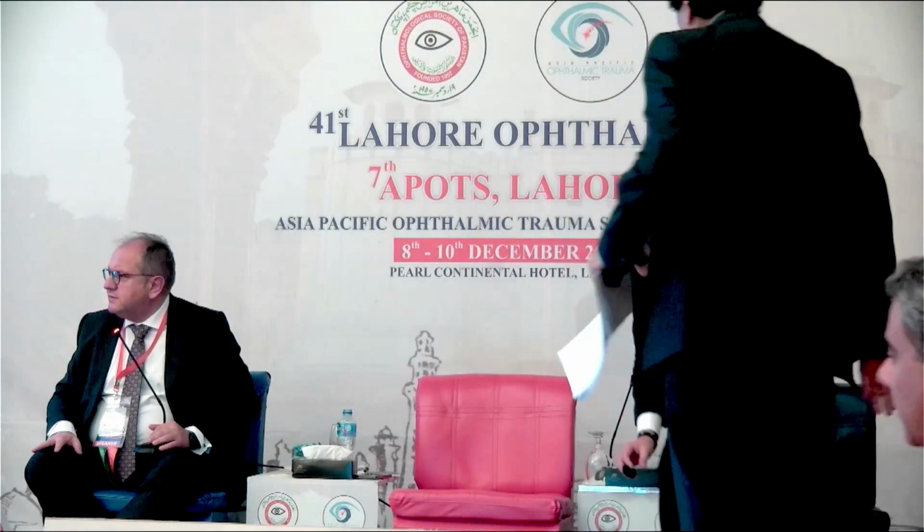If you do that, the ILM flaps or whatever you put over the retina stay in place. A free graft from retina is the same. The fluid can displace any graft, amniotic membrane, or flaps. So if we dry the inside of the eye completely, that is the only reason.